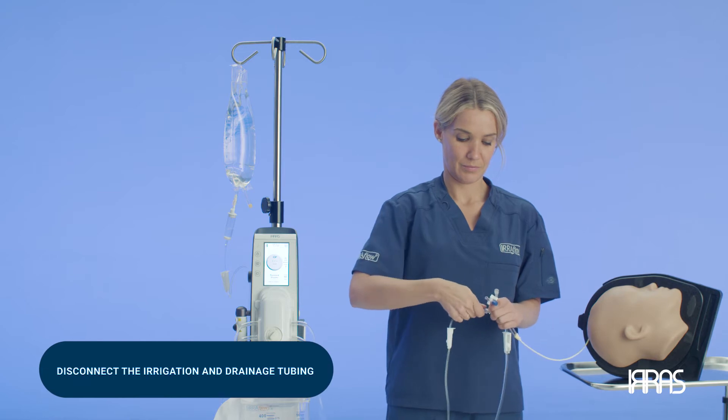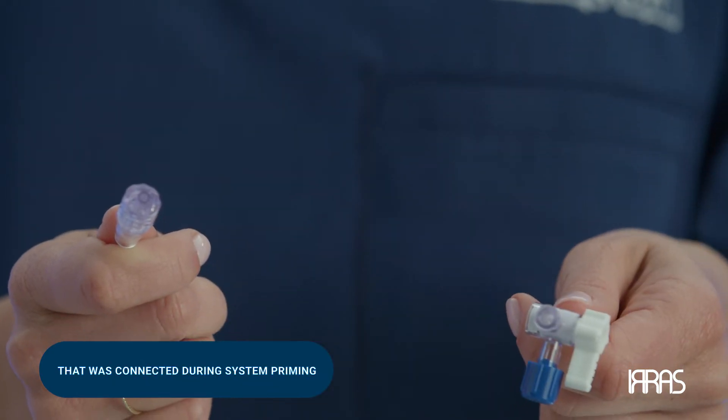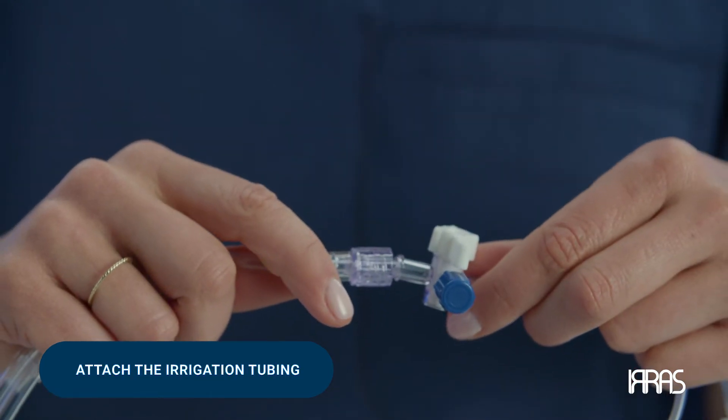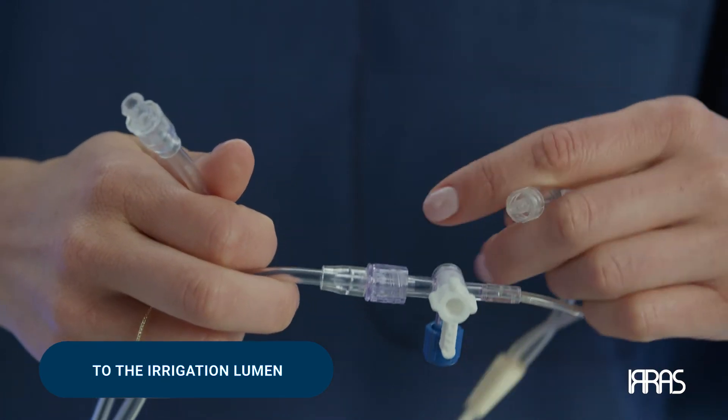First, you'll need to disconnect the irrigation and drainage tubing that was connected during system priming. Once that step is complete, attach the irrigation tubing to the irrigation lumen on the catheter.